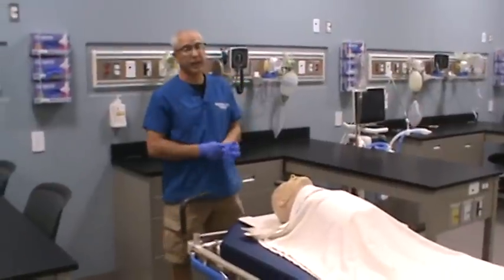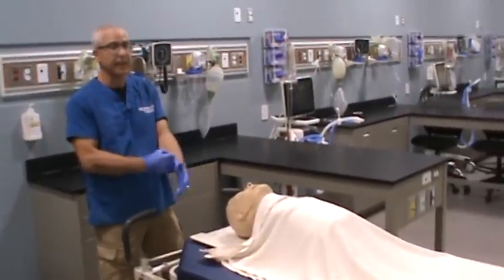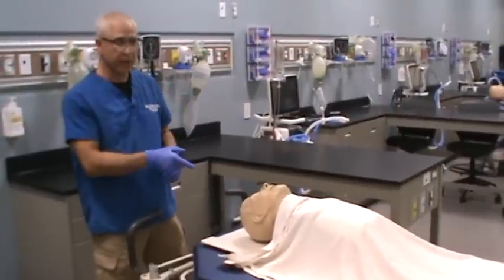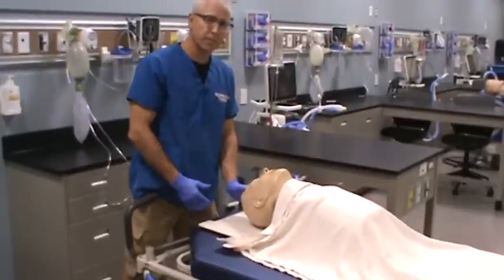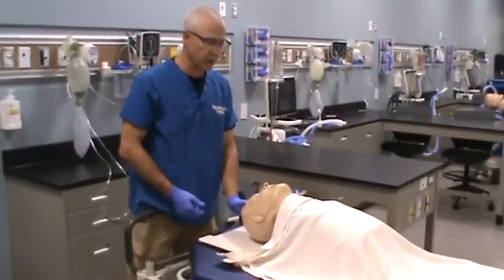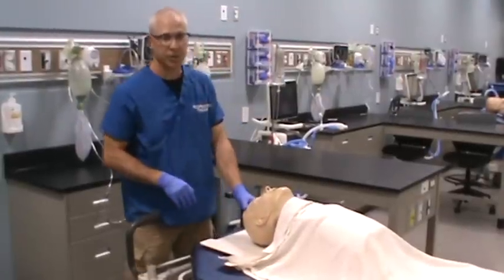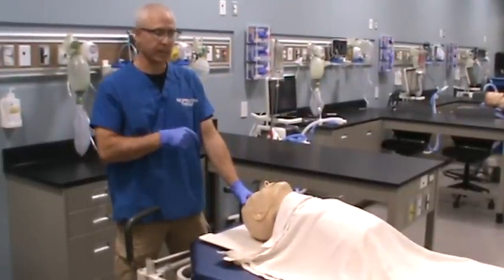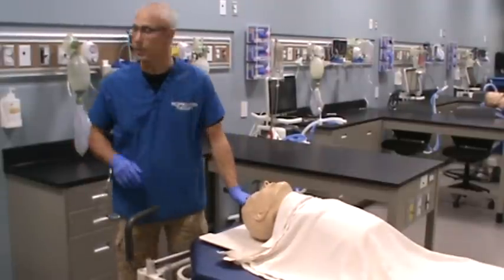Remember, the airway needs to be open. If you're trying to ventilate and can't get gas into the patient's lower airway, it could be due to patient positioning. Make sure you've got a head tilt employed to help open up the patient's upper airway. You might also need to insert an OPA (oropharyngeal airway) or NPA (nasopharyngeal airway) to maintain an open airway.